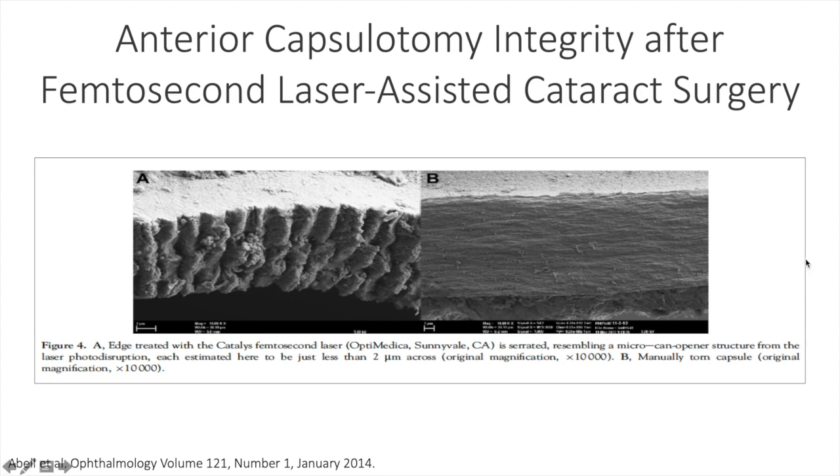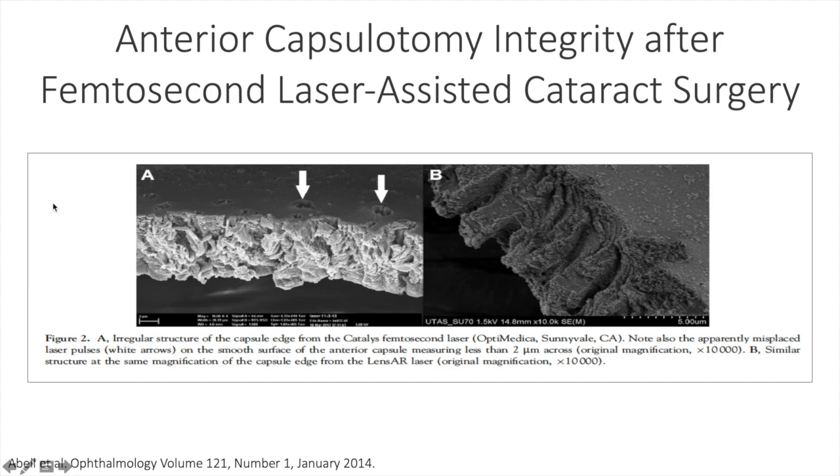You can see here, as I'm pointing towards the continuous curvilinear capsulorexis done freehand, the smooth surface of the edge of the capsulorexis compared to the sawtooth nature of the capsulorexis done with femtosecond laser, and of course this is because the spots are done individually going around the capsulorexis. On face value, you might think that the outcomes would be pretty much the same between the two.